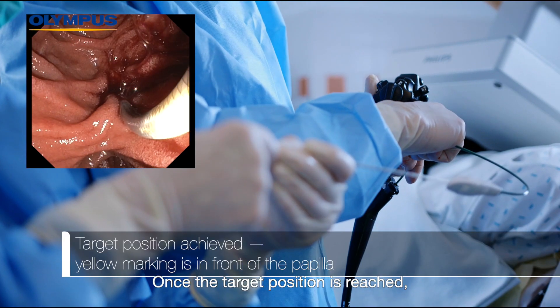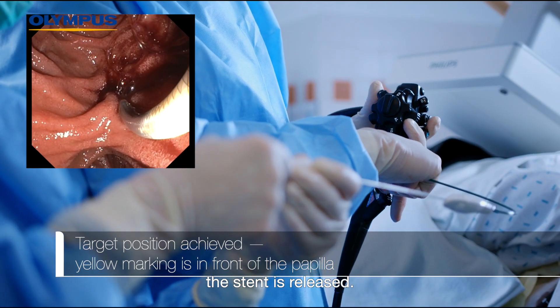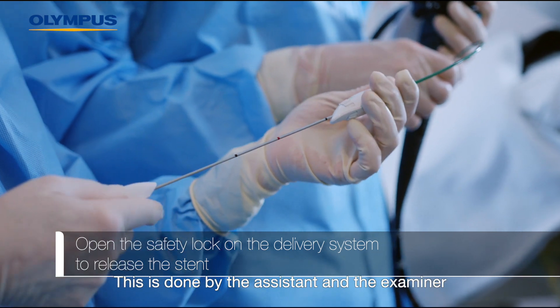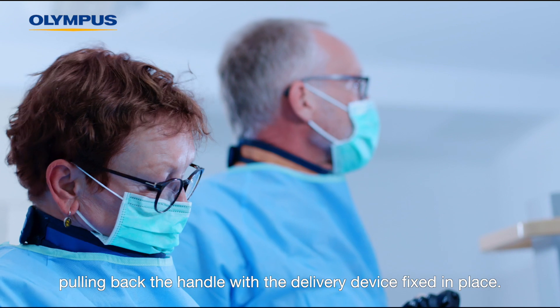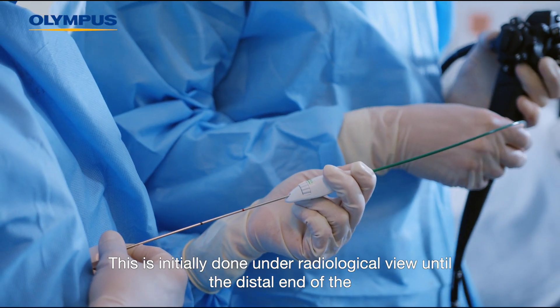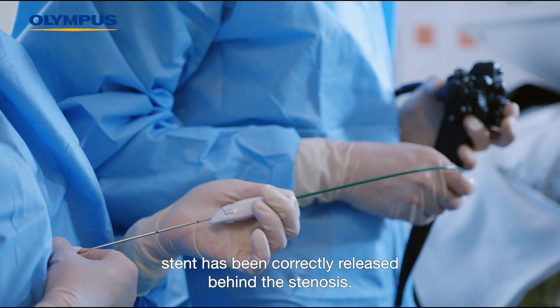Once the target position is reached — i.e. the end of the stent behind the stenosis — the stent is released. This is done by the assistant and the examiner pulling back the handle with the delivery device fixed in place. This is initially done under radiological view until the distal end of the stent has been correctly released behind the stenosis.